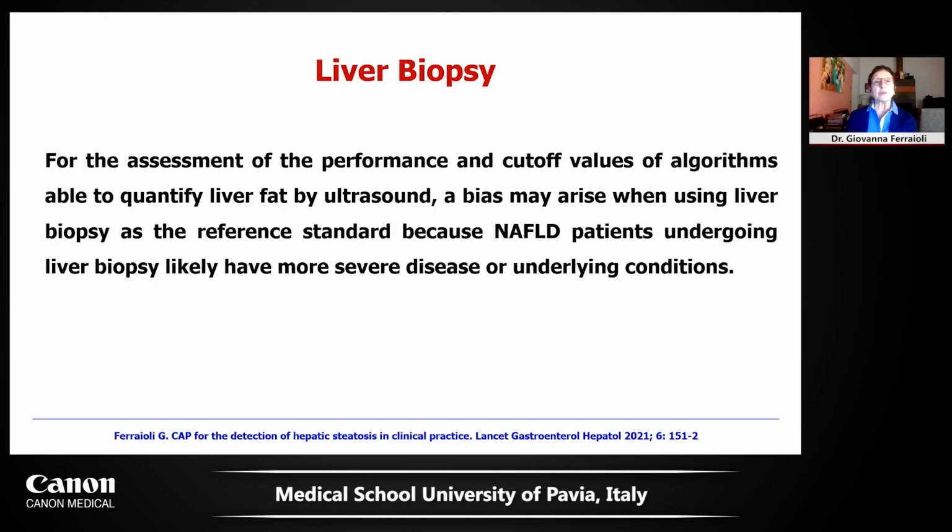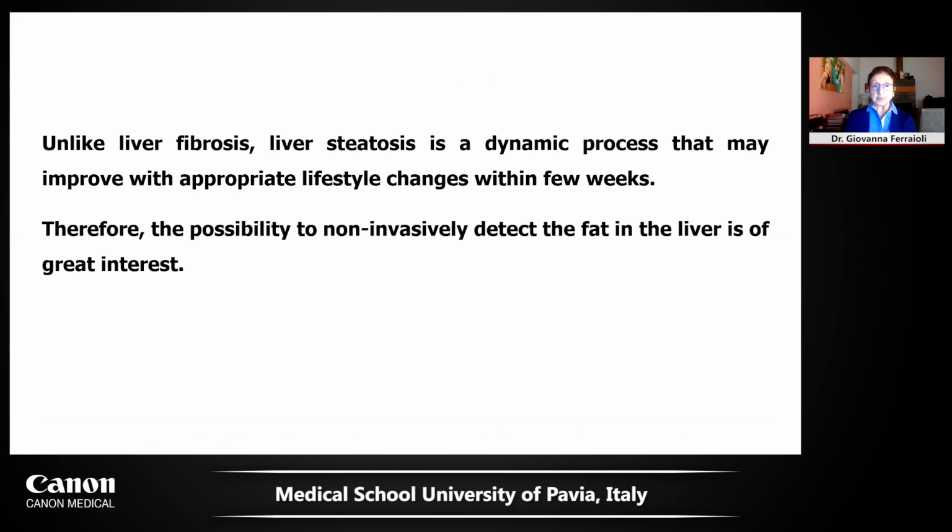On the other hand, when we want to look at the accuracy of the new algorithms that are able to quantify the content of fat in the liver by ultrasound, we have a bias using liver biopsy because the patients that will undergo liver biopsy are likely the patients with a more severe disease or with underlying conditions.